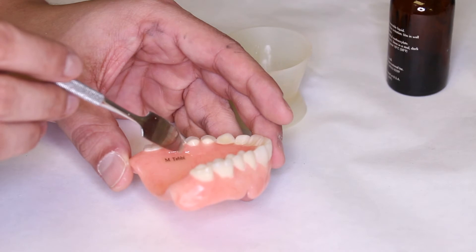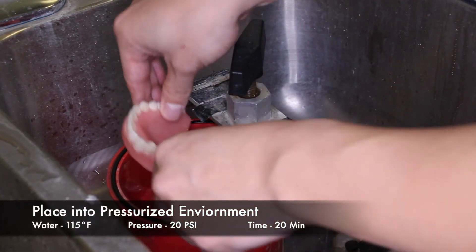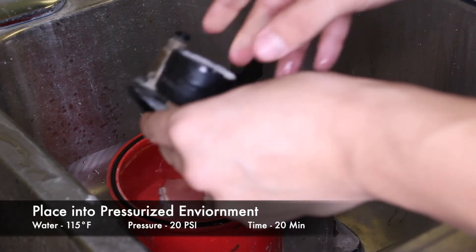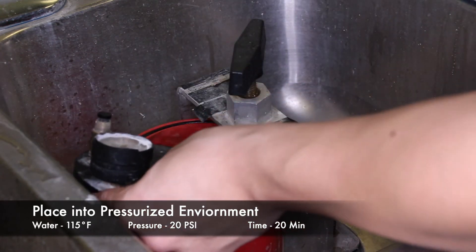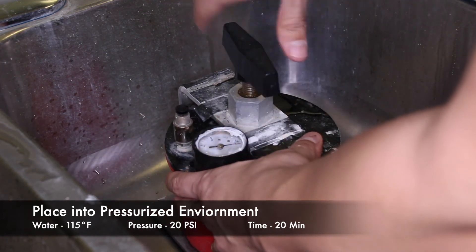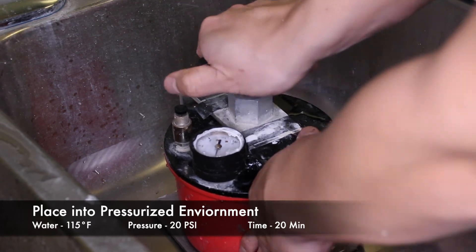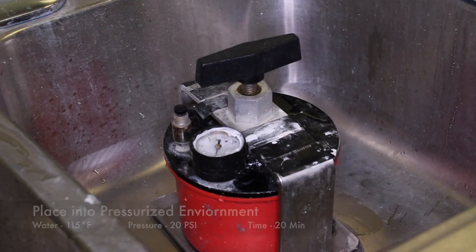Once the ID tag has been completely covered in clear resin, you can then place the denture in a pressurized environment, usually using a pressure pot. The water temperature should be 115 degrees Fahrenheit, the pressure should be at 20 pounds per square inch, and it should remain in the water for 20 minutes.